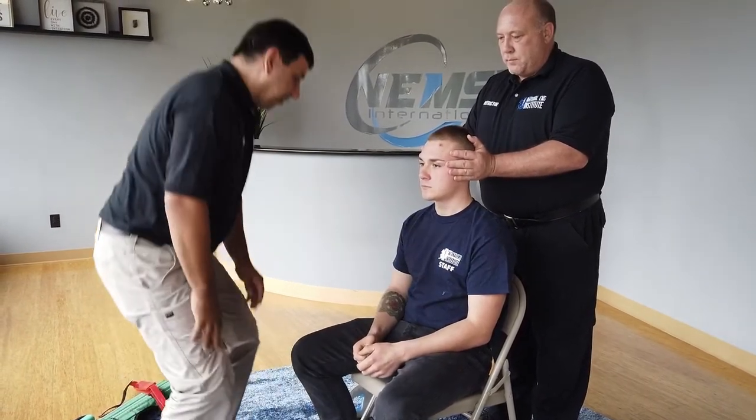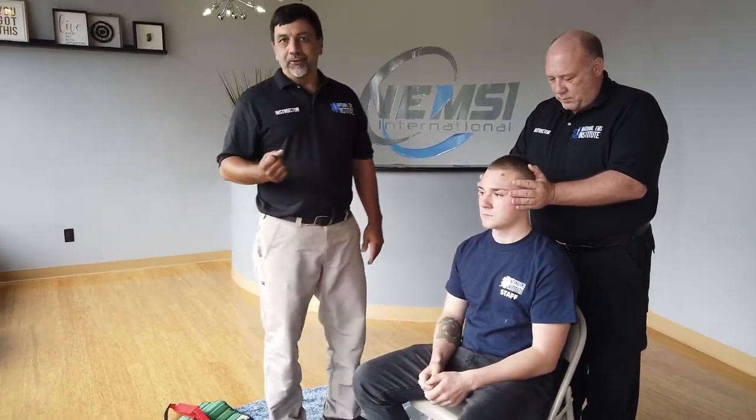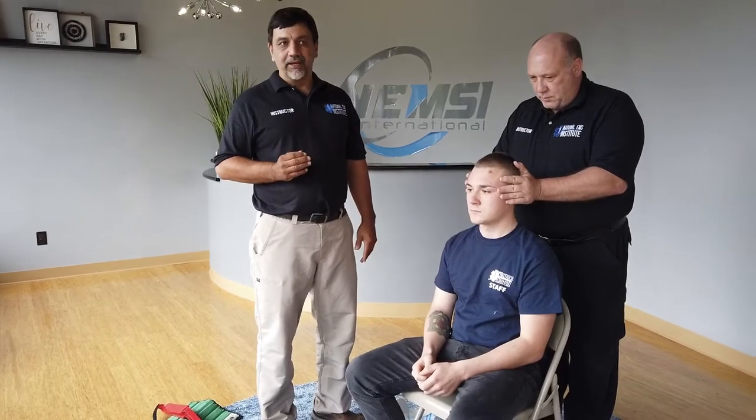This station is going to begin with me and my partner walking on scene and going into scene safety BSI, just like any other station we go. Scene safety BSI. Hi, my name is Charles. I am going to direct my partner and go ahead and stabilize the spinal space. I am going to have him squeeze my hands. Can you move your toes? Check for a pulse. I notice the patient is in a position where we will not be able to get the device behind him.